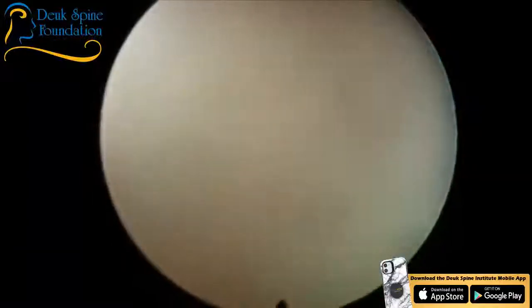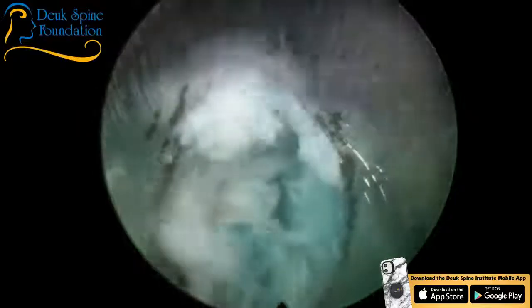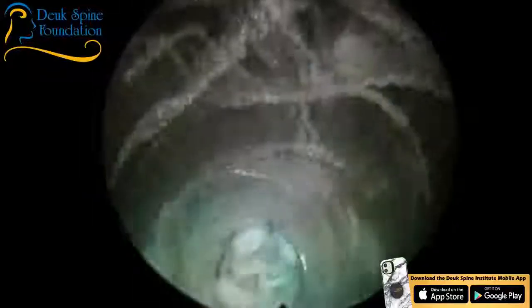How did these pieces of herniation get inside the disc? Well, because I just pushed it in there when I advanced the dilator into the disc through the tear. That tear is where the herniation is. So in essence, I pushed the herniation back into the disc, and now I'm going to remove the pieces. That's one of the advantages of Dr. Young's technique, the inside-out technique, is that you actually reduce the herniation.